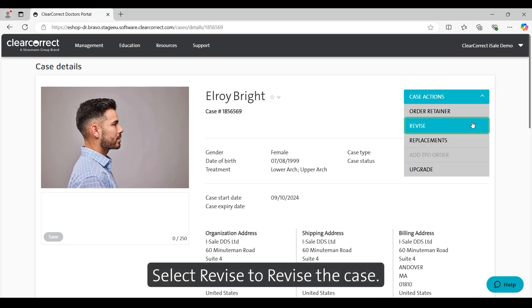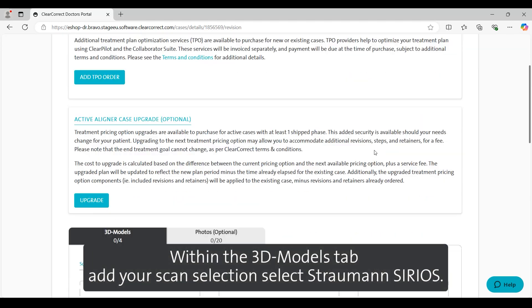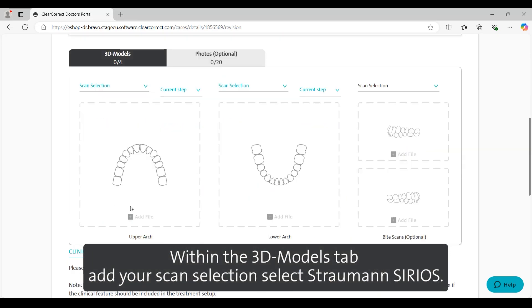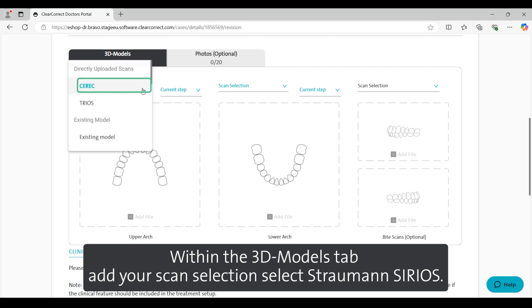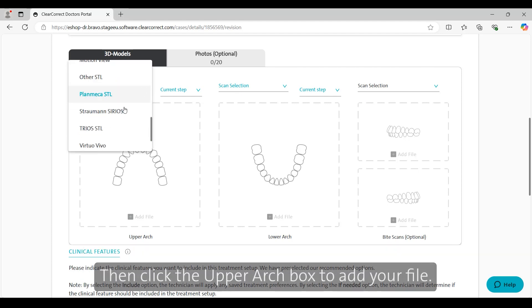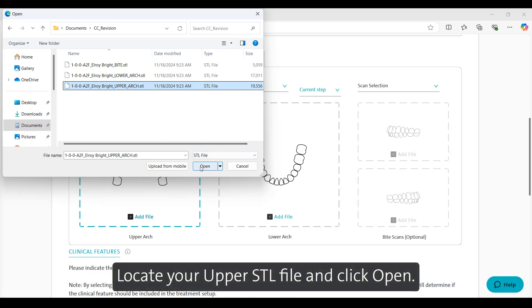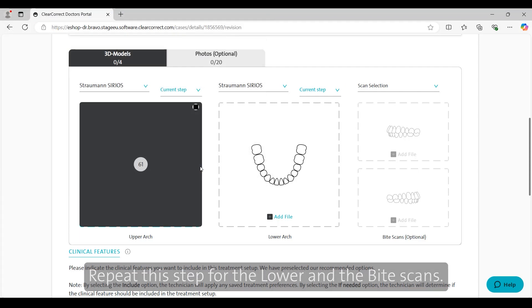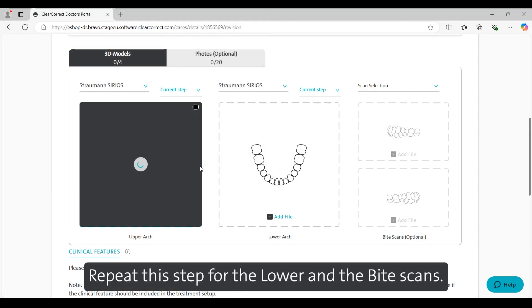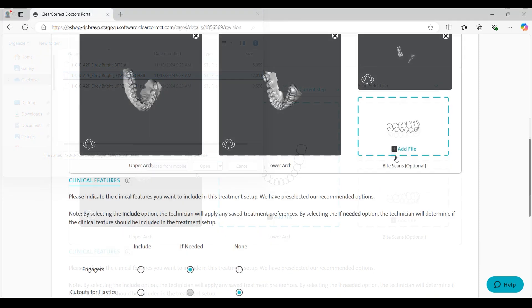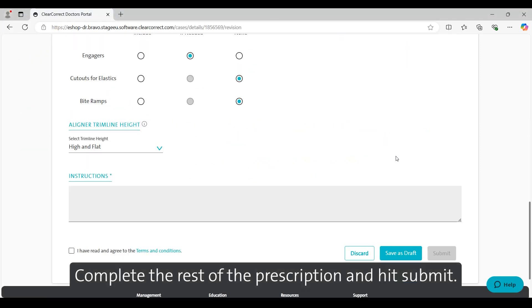Select Revise to revise the case. Within the 3D Models tab, add your scan selection and select Straumann Sirius. Then click the upper arch box to add your file. Locate your upper STL file and click Open. Repeat this step for the lower and the bite scans. Complete the rest of the prescription and hit Submit.